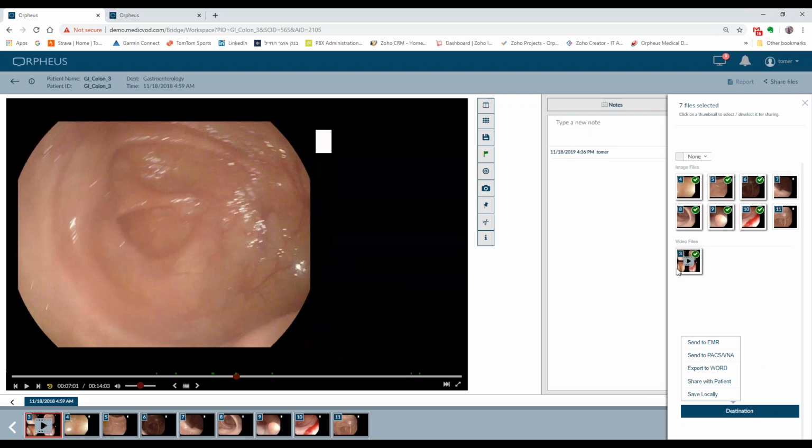Of course, based on what we've experienced last week, it is highly recommended or required not to select a video when doing that, in order not to cause our service to get stuck. We are working on adding robustness and preventing that endless retry loop from occurring. And once we have a fix for that, we'll be able to deploy it on your environment as well.